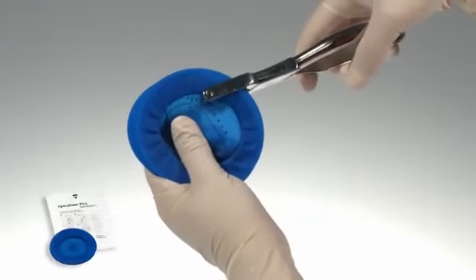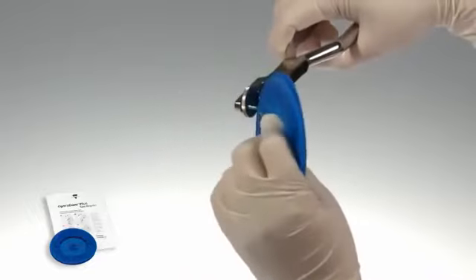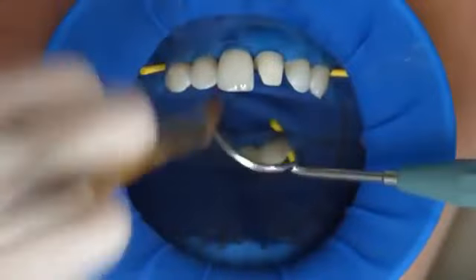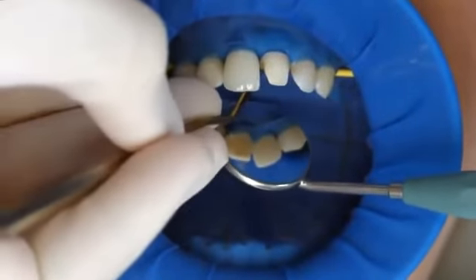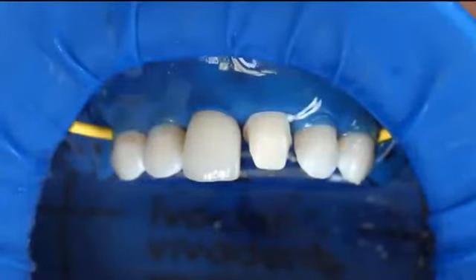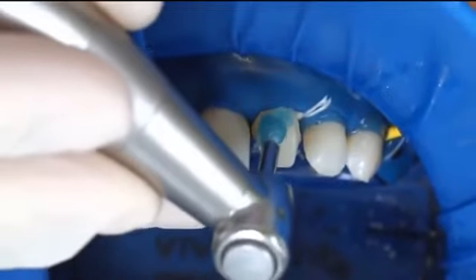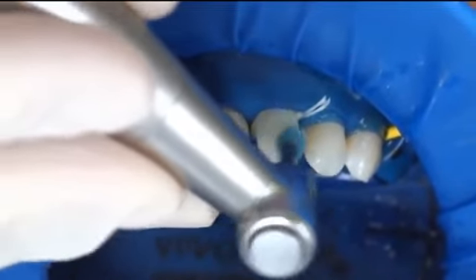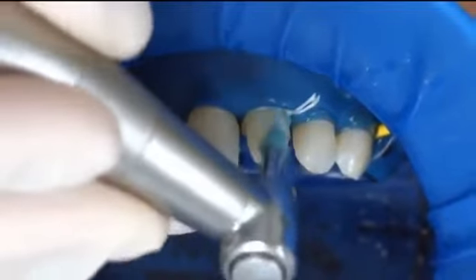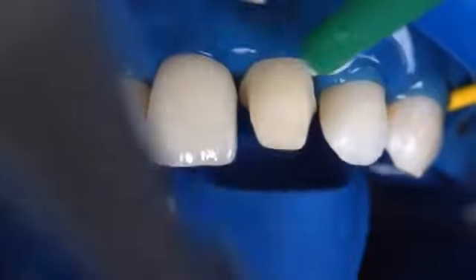When an adhesive luting protocol with composites is used, reliable isolation of the operating field is indispensable. Preferably place an anatomically shaped rubber dam such as OptraDam, or alternatively use cotton rolls and a saliva ejector. Clean the preparation again with a polishing brush and a fluoride-free cleaning paste such as fluoride-free Proxyt. Rinse the preparation with water spray and dry it with air. Avoid over-drying.